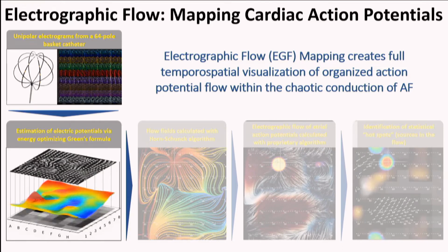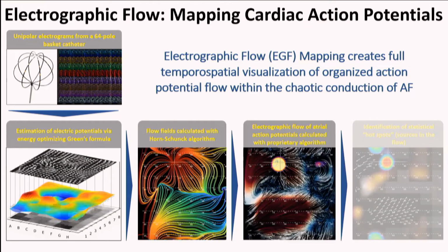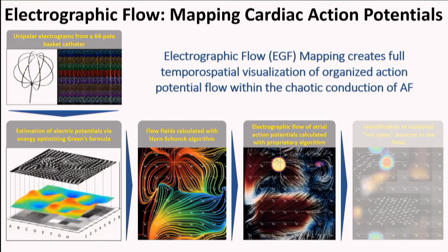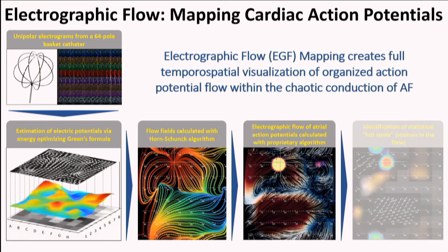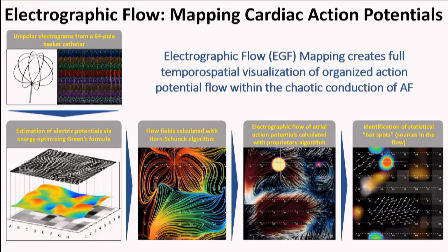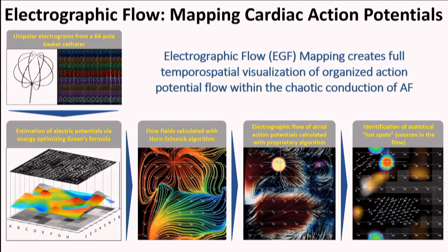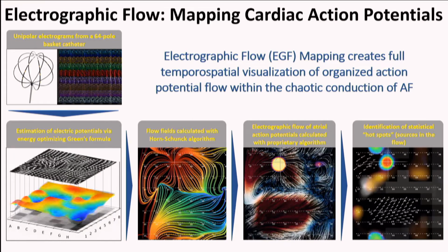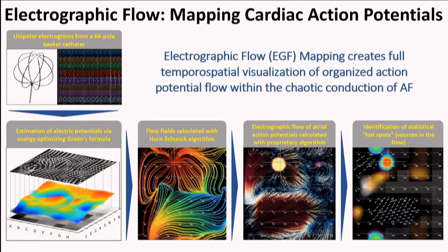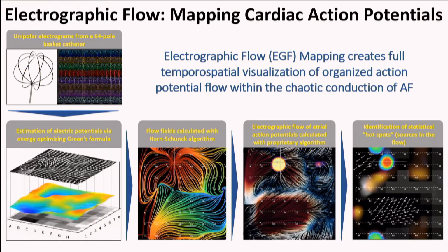Then the electrical potentials are evaluated, the flow fields are calculated, and then we end up with these EGF flow maps. What you're seeing here is a 2-second depiction of the flow, and what you see here is a statistical understanding of a full minute. So if you take all the 2-second recordings and put them together, then, for example, that red hotspot will represent an area where there was this rotational activity more than X% of the time.